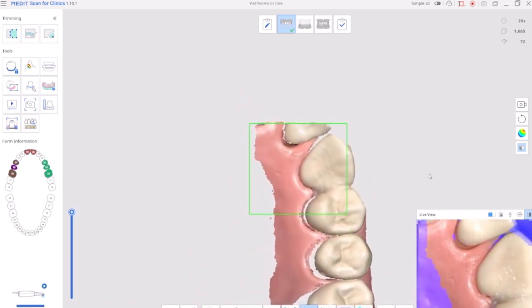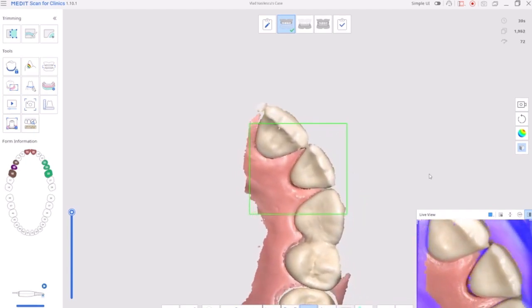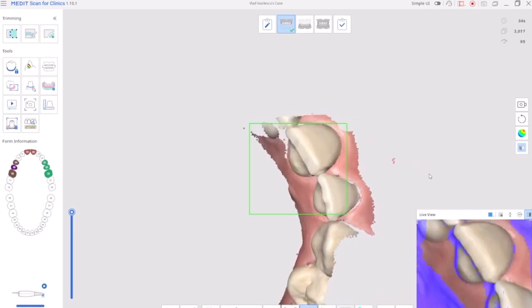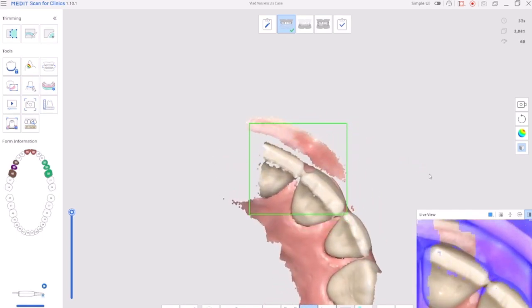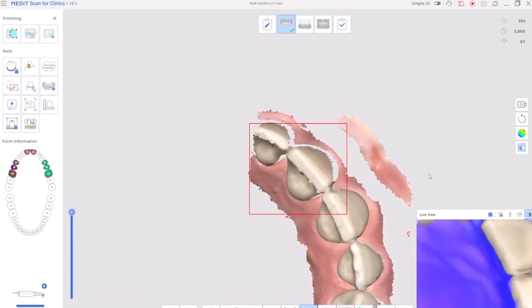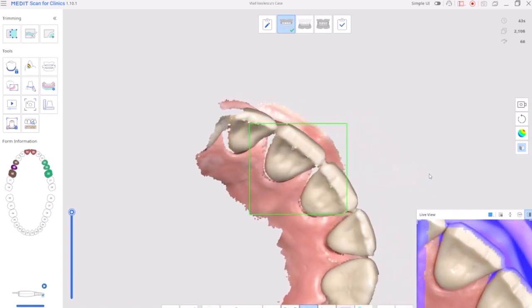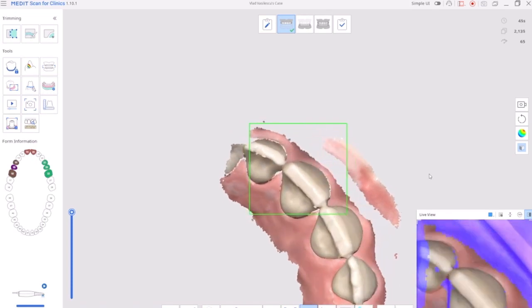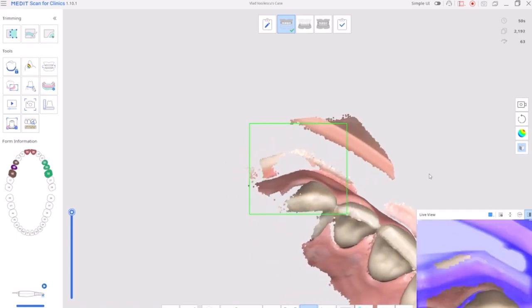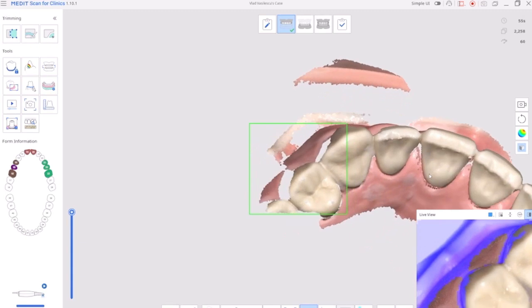So now the scanner is singing, so to say, making the specific noise. We start with the teeth on the lateral region first, the occlusal side, as we said. So we continue towards the front. And here we can do some sort of rock and roll movement. And you see, there was a moment when the scanner was lost, so we had to come back to a position that the scanner could recognize.